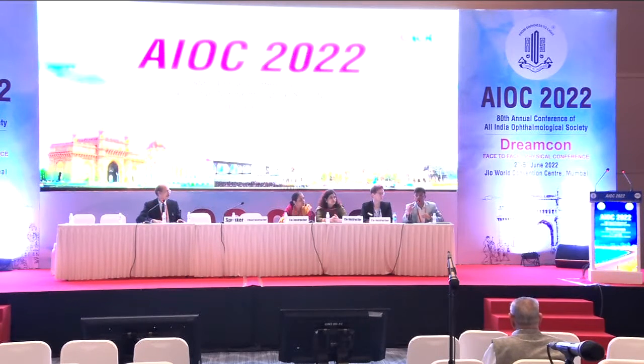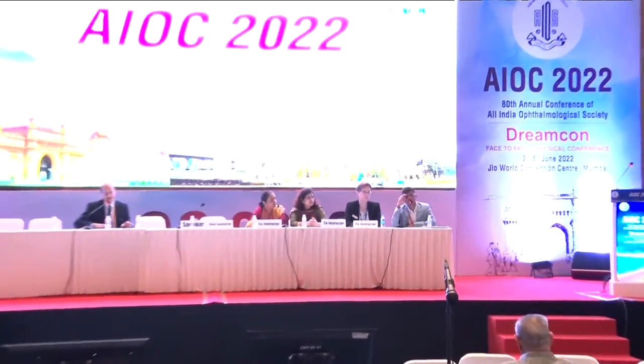Actually, madam, as I was mentioning, if you compare a SITA standard with 24-2C, you will find changes in the global indices. So it is a good test if you have a new patient where you're having glaucoma suspect, you want to have a test, you can do a 24-2C because you will be checking a lot of new points, plus the central points also you will be able to detect. But if you're doing a follow-up or you're comparing a patient who is already on glaucoma, there will be changes in the global indices, so it will be difficult for you to see the progression. So I think for new patients, it's a better option than for patients who are already on treatment.